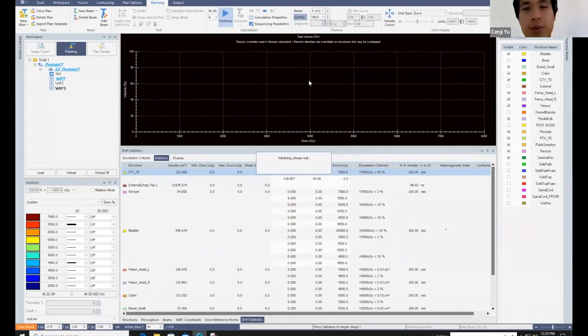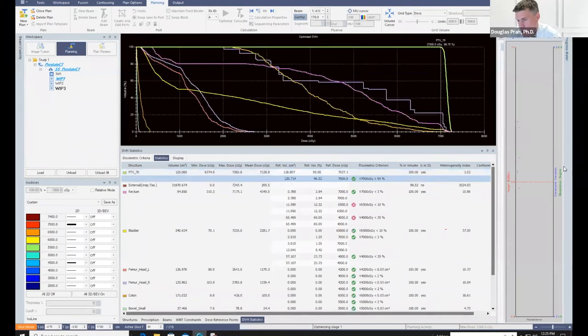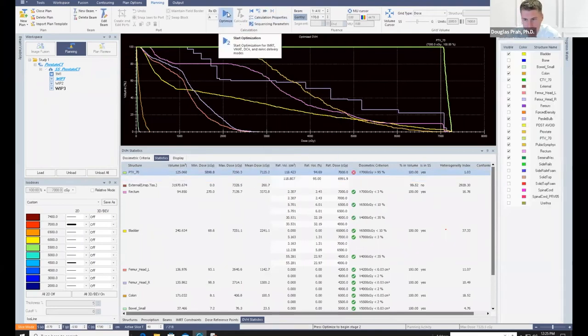Dr. Parr, while we're optimizing, I'm gonna insert another question. They're asking what is the inference from progress meter, and what is the permitted degree of modulation from the progress meter? So there's the modulation degree. So the more modulation. So if you, this is much faster. So here, I just want to make sure this is still looking good, and then we'll kick this into. And I will talk about these while these are running.